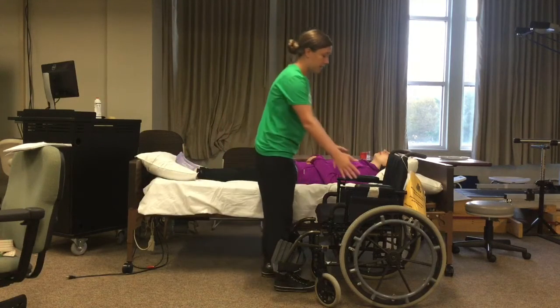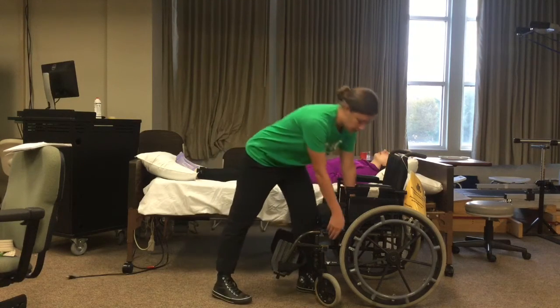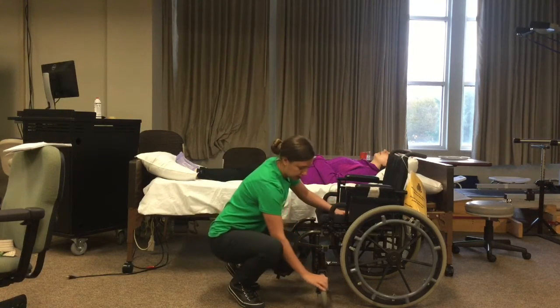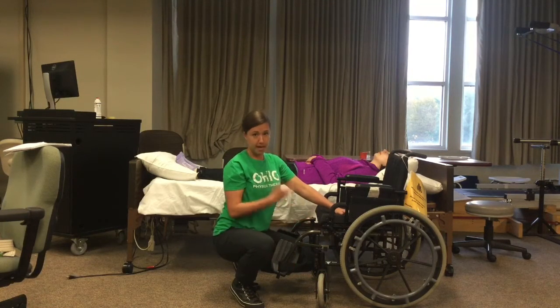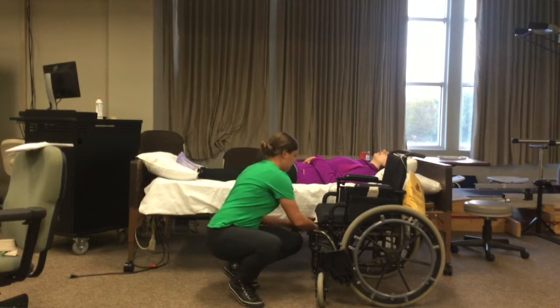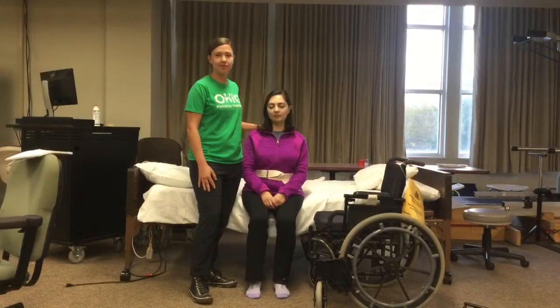Okay, so first thing that we're going to do is set up your wheelchair positioning, and I want to have it parallel to the surface I'm transferring to and as close as you can get it there. We're going to make sure the wheels are locked, and you might want the wheels actually facing out to the side so that they don't get in the way of mine or the patient's footing. We're going to swing the footrests out to the side or remove them. And last, you're going to remove the armrest that's closest to the side of your transfer.